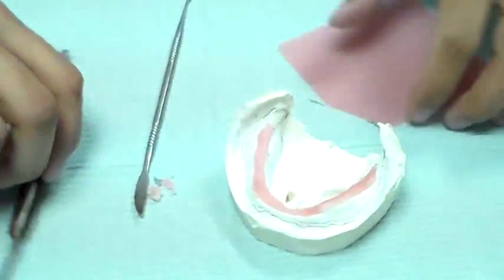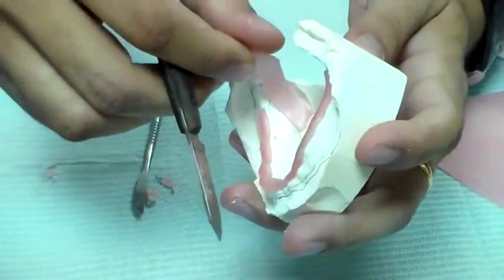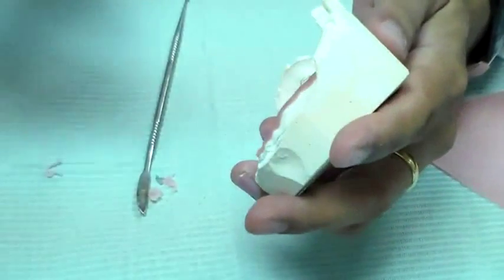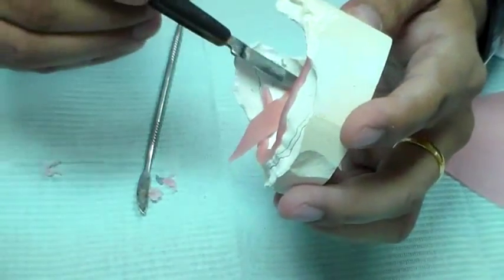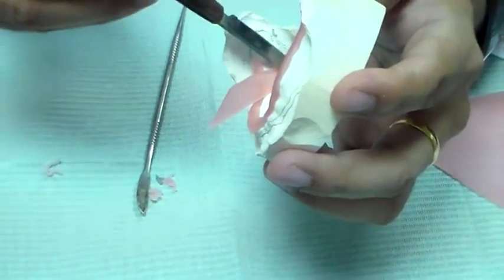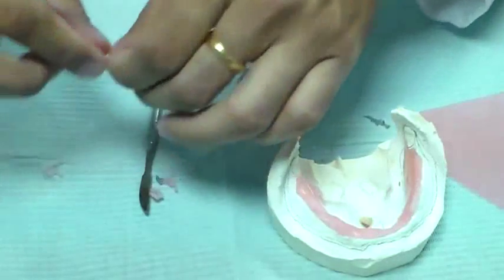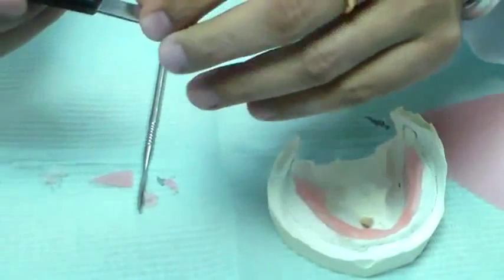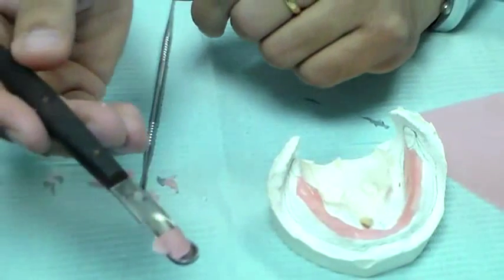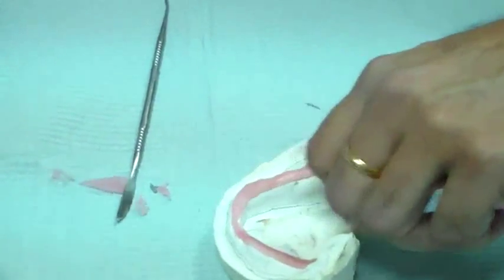Now do the same thing on this side — take a bit of wax, soften it a little bit, and adapt it on there. You can use the wax in the spoon — heat it over your flame and it starts to melt so you can appreciate the spoon effect. Heat it up and now you see the wax in the spoon is melted, and you can just pour it in like that.